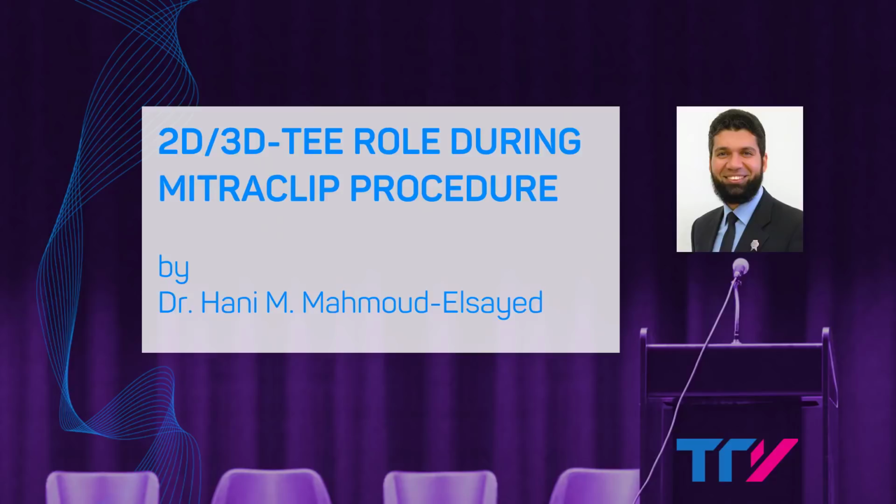I'm Hani Mahmoud from Egypt. I'm going to speak today about the 2D, 3D-TEE role during MitraClip procedure.